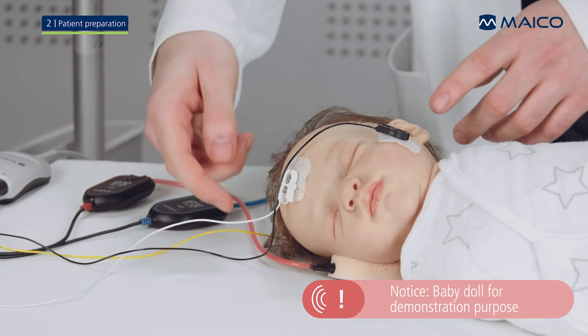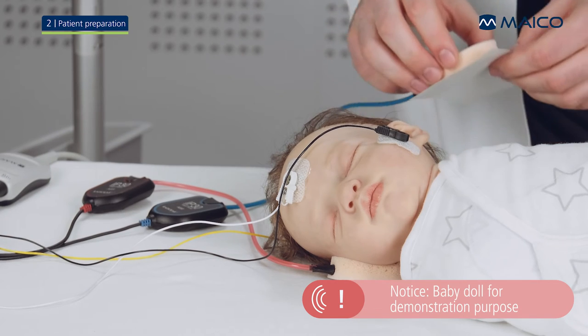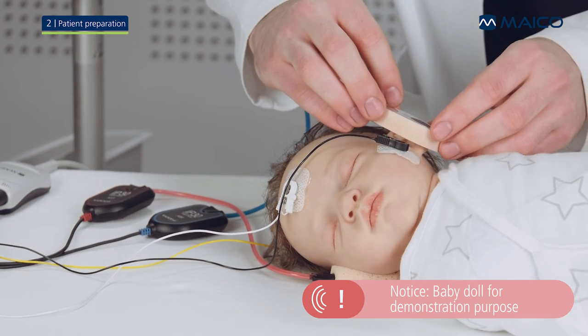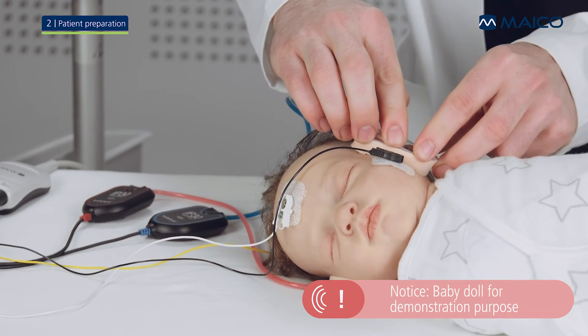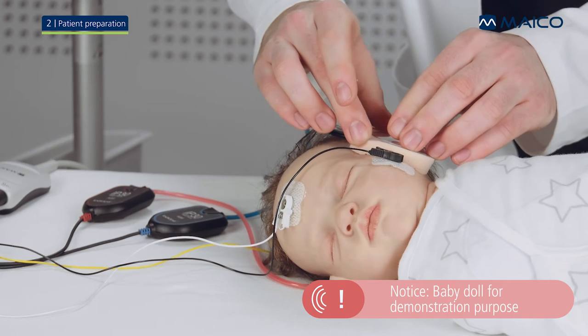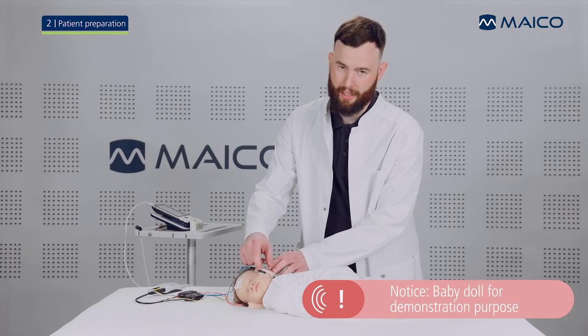Place the ear cup with the red tube around the baby's right ear and the ear cup with the blue tube on the left ear. Ensure that the ear cups are well attached to the baby's skin without leaving gaps.